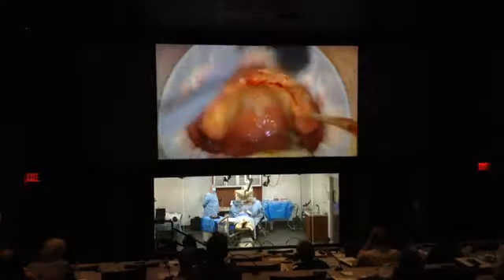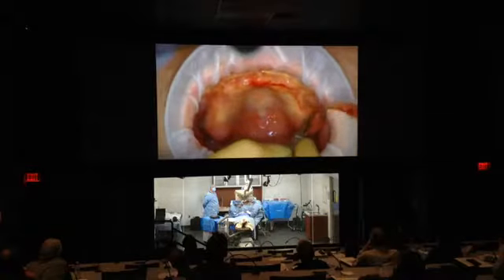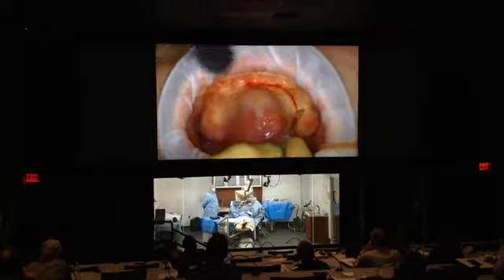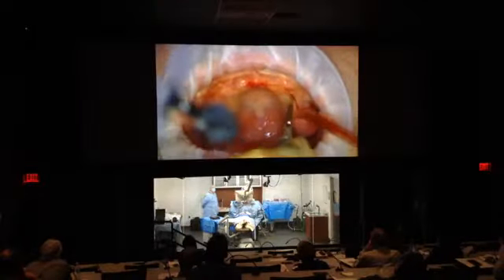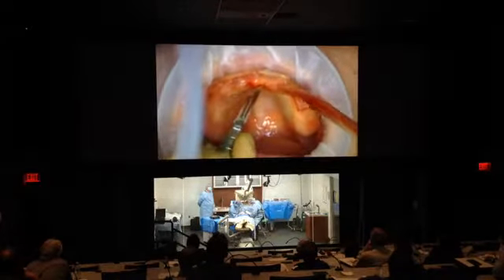That's actually at the first molar site. Okay. So obviously when we have somebody dentureless like this, it was hard to tell where that first molar position would be, unless you had a surgical guide. So very important for those of you who are planning on doing these surgeries to have a good surgical guide.